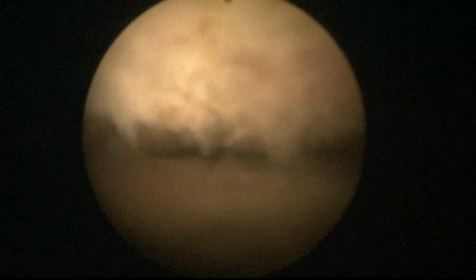We did a relatively fast change with the morcellator and, sorry, to the nephroscope. High waters, new, refilled. And the morcellation starts. Here. You can see the big gland and how morcellation is being quite good from the beginning.